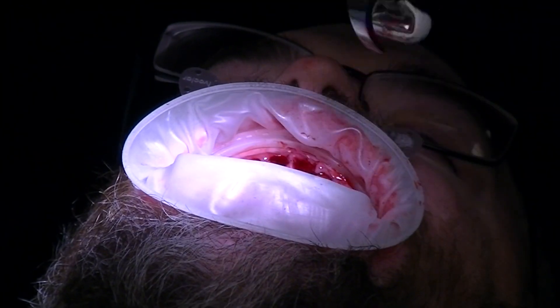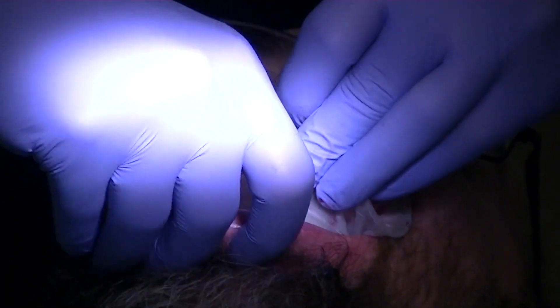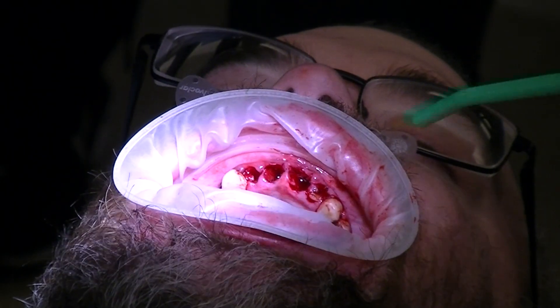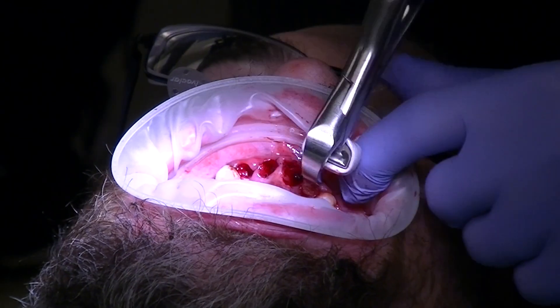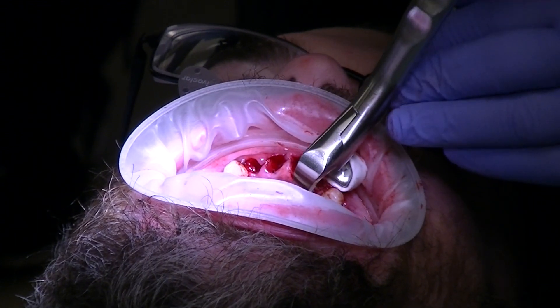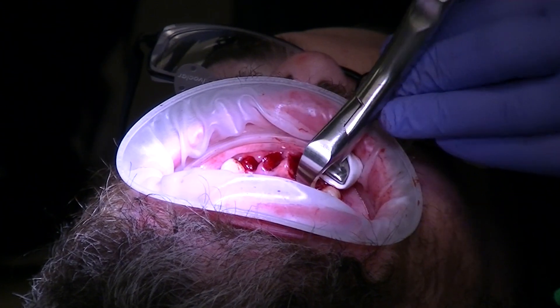Number 10 looks like it's broken off at the gum line. I'm not a big fan of the opter gate for that reason — in my practice I use the metal retractors that surgeons use; those keep things out much better. Same thing — get a little bit of leverage. Does everybody see how I'm using two hands?